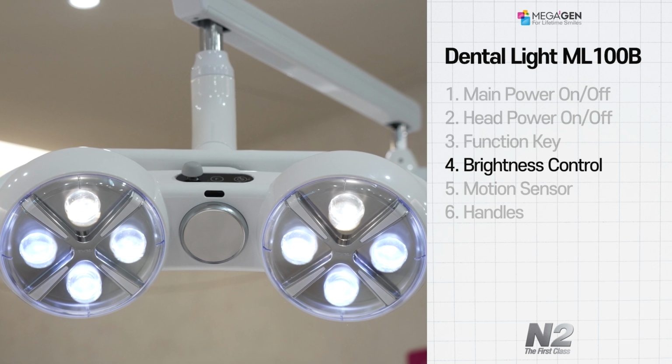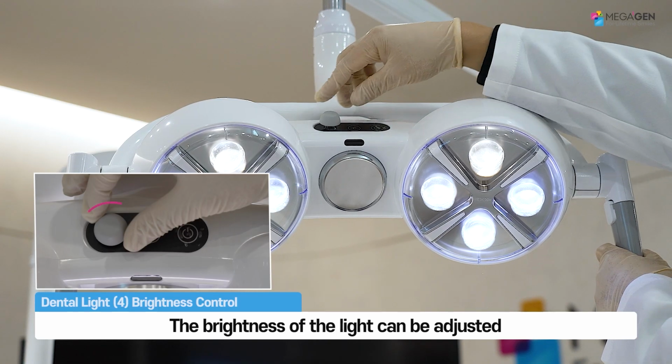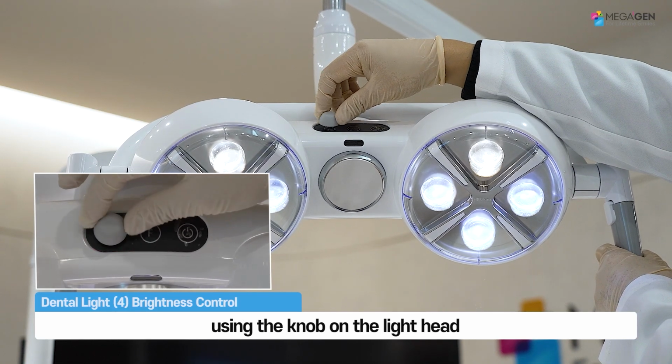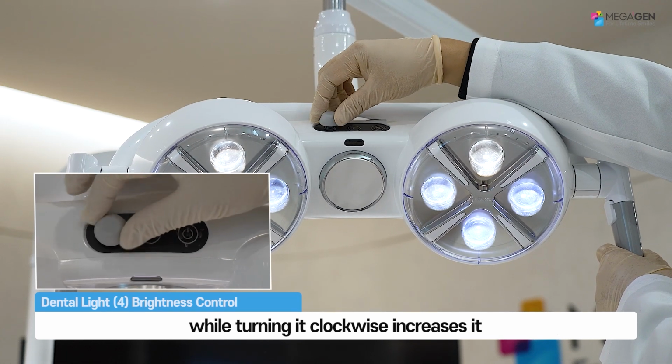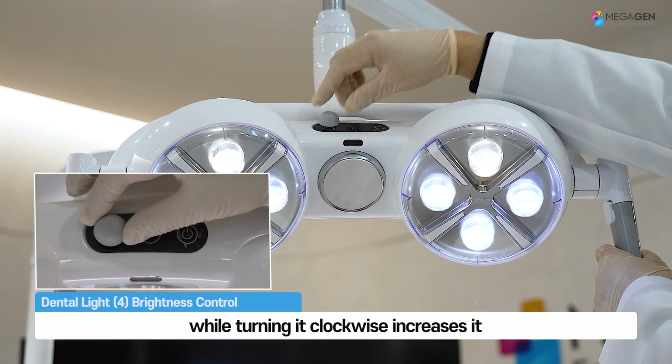Light brightness adjustment function. The brightness of the light can be adjusted using the knob on the light head. Turning the knob counterclockwise lowers the brightness, while turning it clockwise increases it.